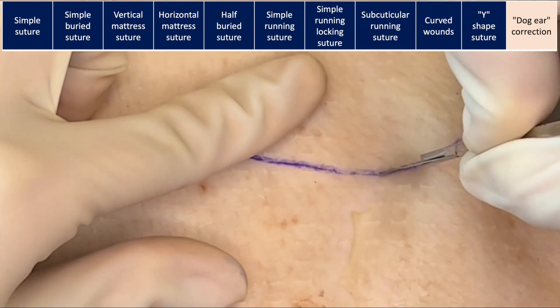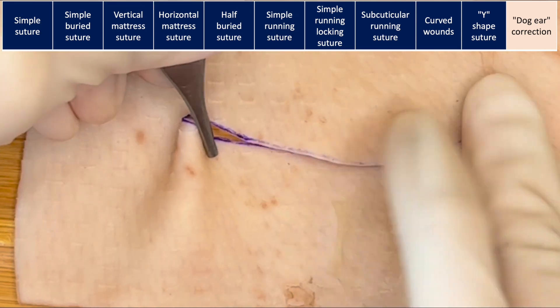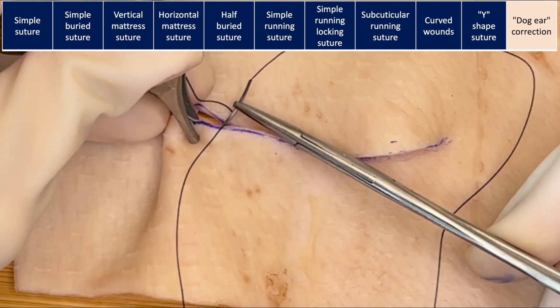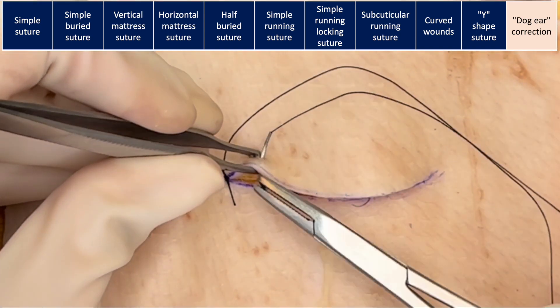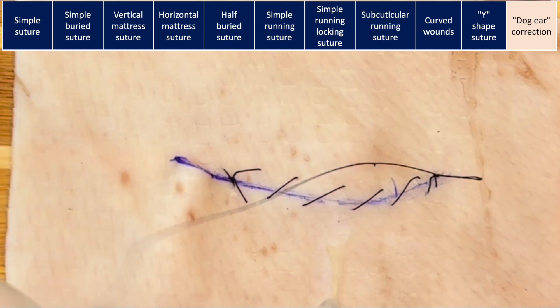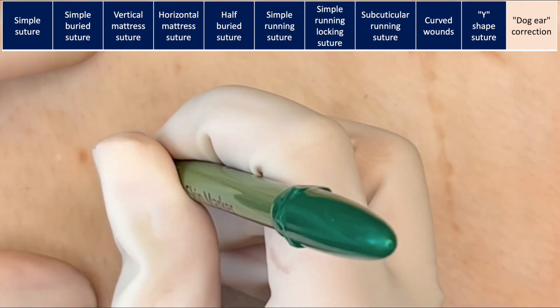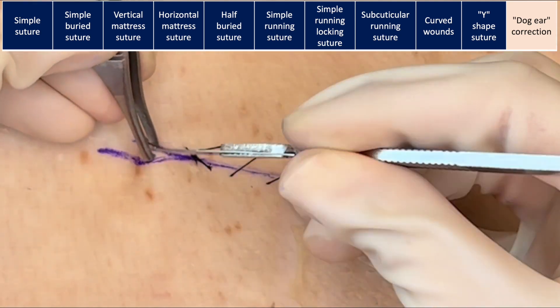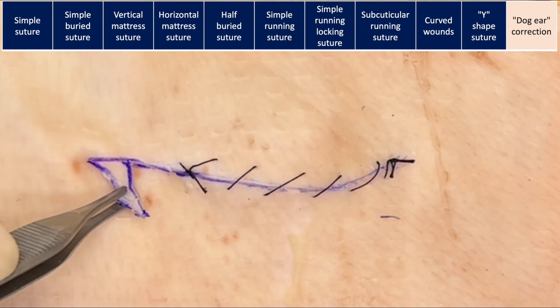Now we're going to correct a dog ear. First, let's recreate one — for this example, I'm using a layer of pig skin bought at the supermarket. When we don't align both edges of the wound properly with sutures, we generate a dog ear at one of the ends. I'm going to show you the technique I prefer because it has consistent results and you can plan where the resulting scar will be located. We mark the spot where we want the resulting scar — on the same side as the dog ear — then cut it and pull that piece of skin downward to figure out where to make the new cut to achieve proper alignment. We mark the cut on the skin.